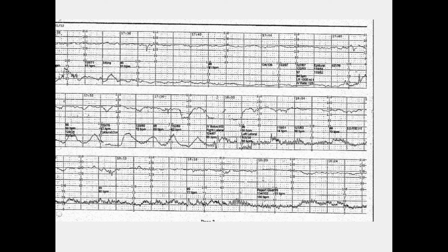So this whole case of this heart rate pattern, I'm pulling out little snippets to show you. There's a lot going on. You can see here the baseline a little bit more clearly. Can you comment here on what you think the variability looks like?